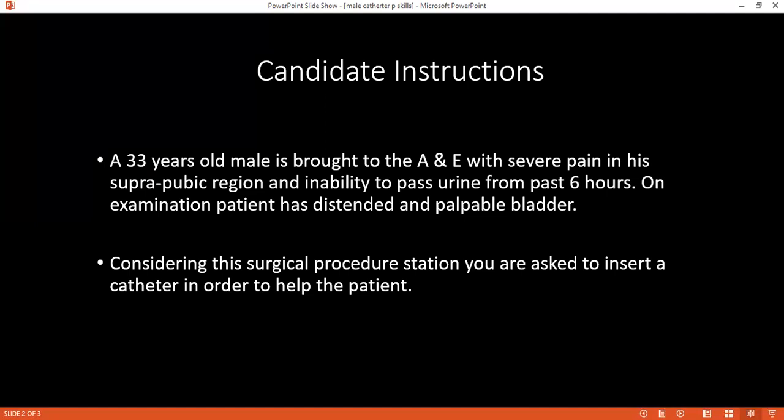So now I'll prepare the equipment. I'll ask my assistant to give me 2 sterile gloves and 3 gauze pieces and a sterilizing agent, betadine, forceps and sterile drapes, and I'll ask him to give me a local anesthetic. What would be the size of the urinary catheter that you are going to pass?